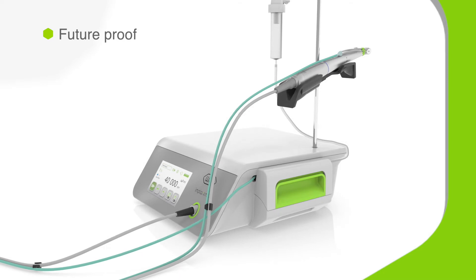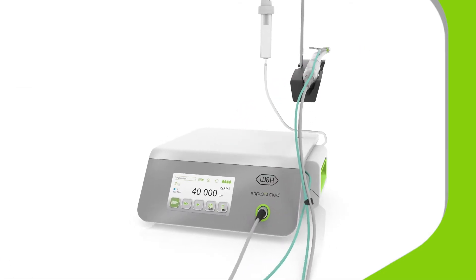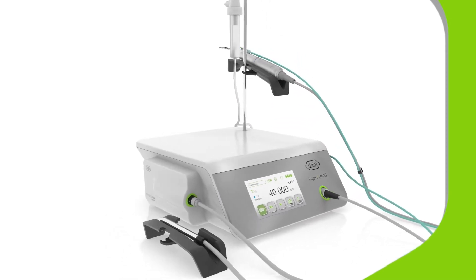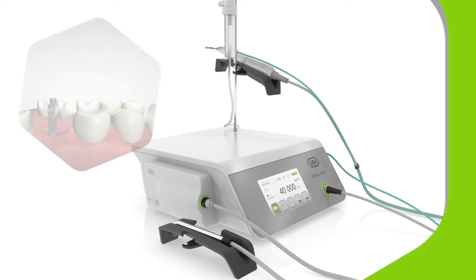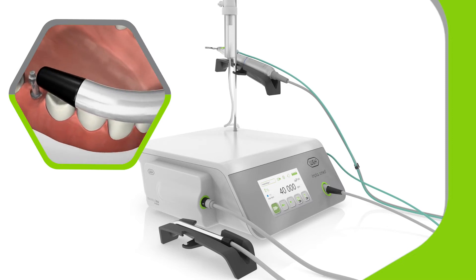You can upgrade ImplantMed Plus in two ways, increasing its functionality and making it fully future-proof. Adding the Ostal ISQ module lets you non-invasively measure implant stability to determine which implants can be treated and which require additional healing time.